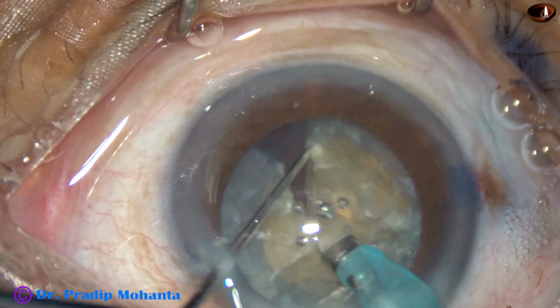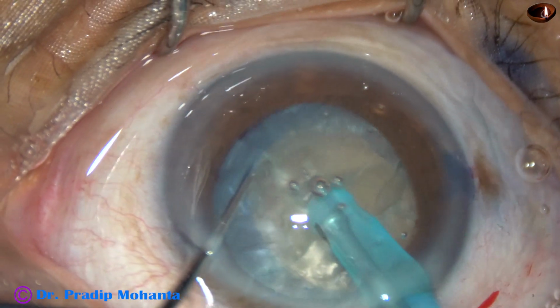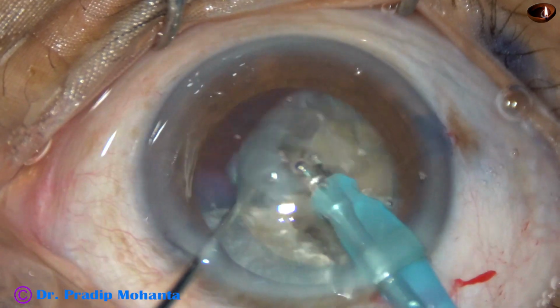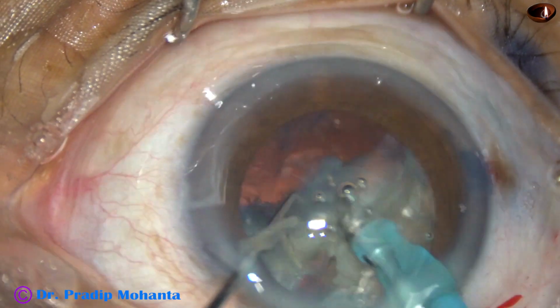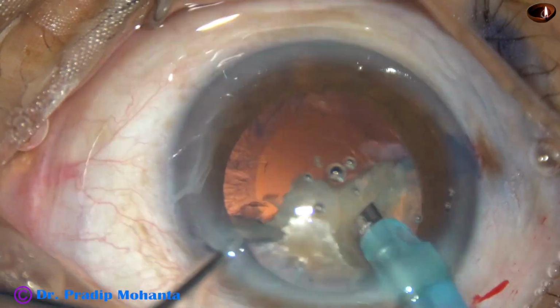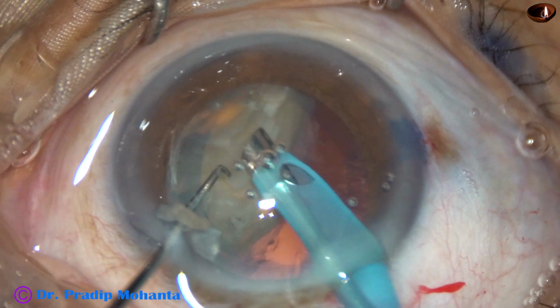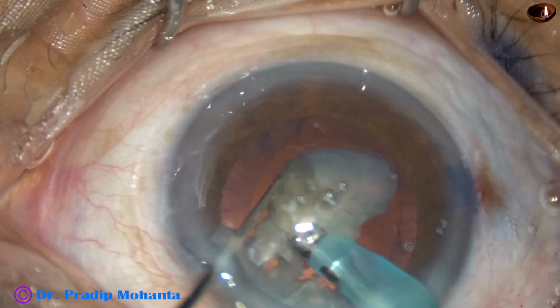What I could have done is I could have divided the nucleus completely into two halves and then divided the two halves into two parts. But in this case I didn't do that. This nuclear piece is free, and this one is also free, and I have removed these two. But these two fragments are joined to each other centrally, and here I am trying to crack it in smaller parts.